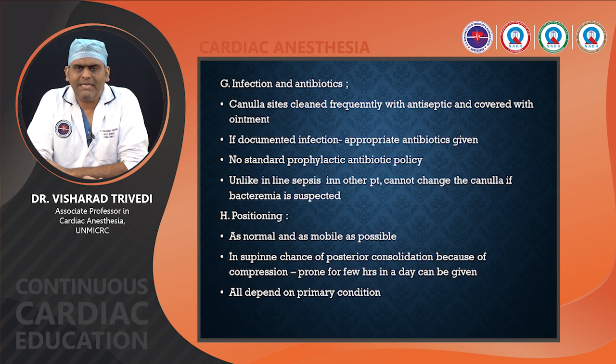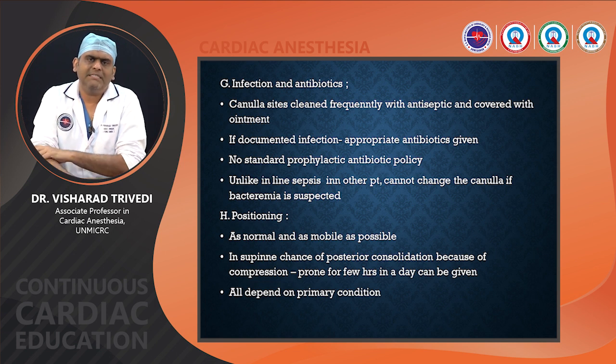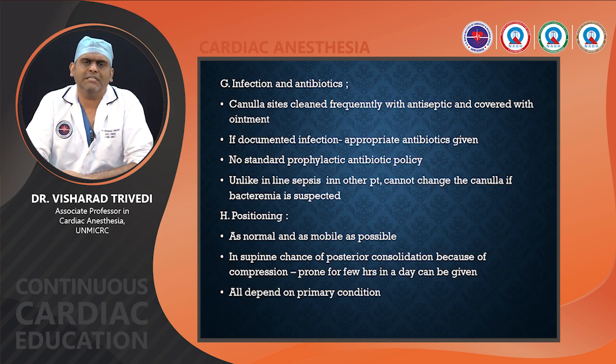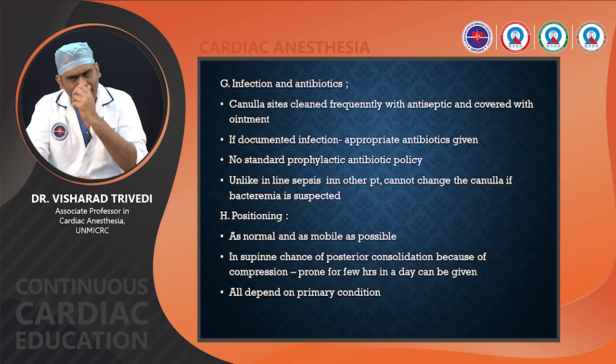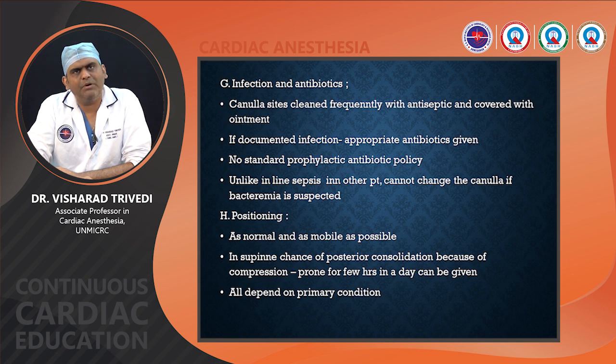So cannula sites are cleaned frequently with antiseptic solutions. However, in this set of patients, if you find the blood culture is positive, you don't have the option of decannulating right now. Right at that point of time, you don't have the option of removing the source of the infection, unless the patient is severely septicemic. So try to maintain the antiseptic environment. There is no actual empirical antibiotic therapy that should be given in Veno Venous ECMO, but if you suspect any infection and you have a culture, then you have to give antibiotics according to the culture report.